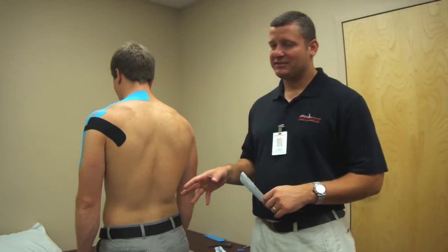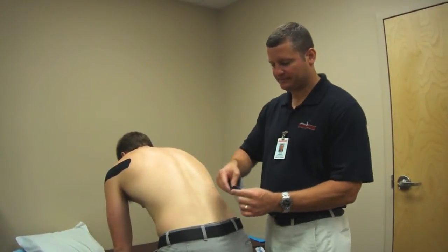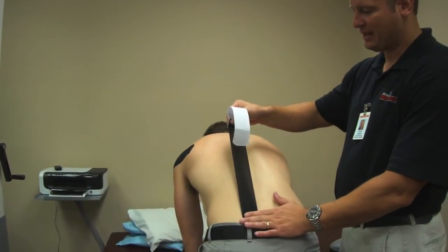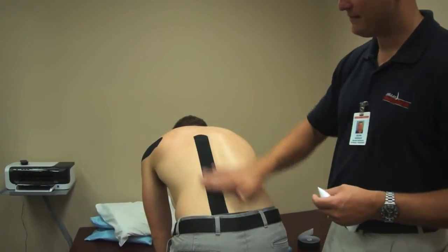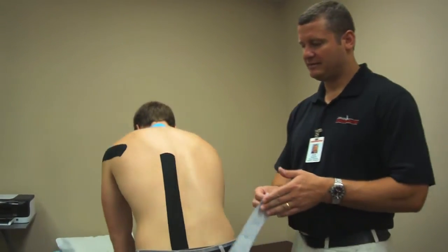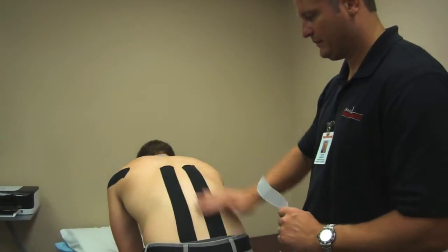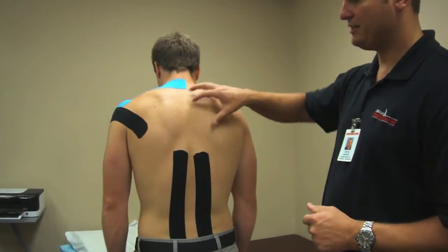Next tip will be for lumbar strain or back pain or lumbar radiculopathy. Start right around the top of the sacrum. Anchor it down, provide just a little pull, and in the kinesio taping world, less is more. You don't have to have a lot of tension, about 25%. Roll it down, and then no tension on the end. Rub that to activate the tape, and then same thing on the other side. As far as the length, this kind of determines where they're having their pain. You can actually go all the way up.